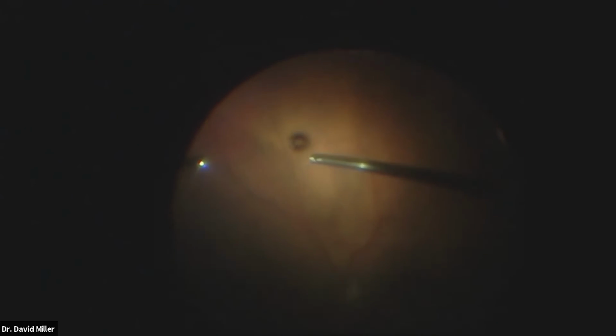Now, one thing you have to be a little careful or cognizant of, we are risking hitting the lens here too. Trying to hold the retina back. Even at low flow, you can get engagement of the retina. You can come out of there for a second. Just bring the eyebrows over. Yep, because it's hitting on something.